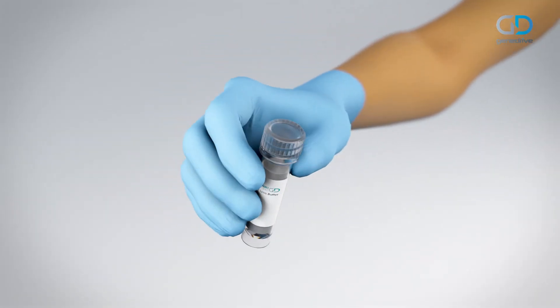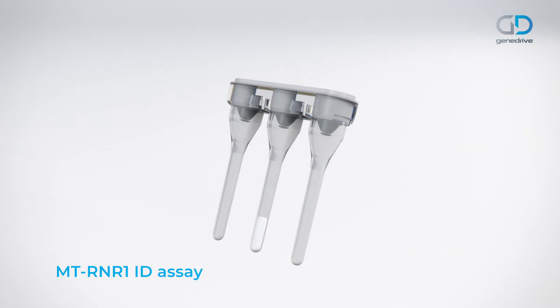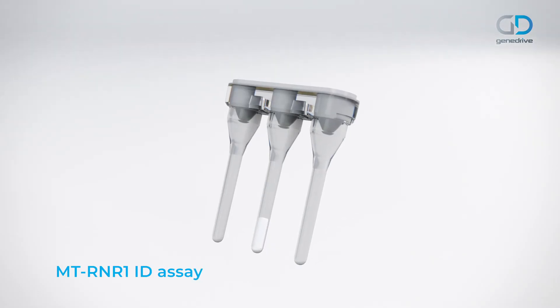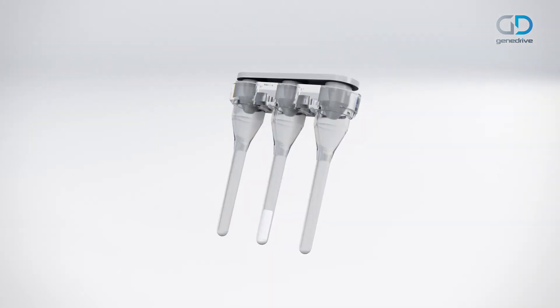Briefly mix the patient sample by inverting the buffer tube. Next, remove the MT-RNR1 ID assay from the foil pouch. Ensure that the dried reagents are located at the base of the middle tube. Remove the strip cap from the assay cartridge.